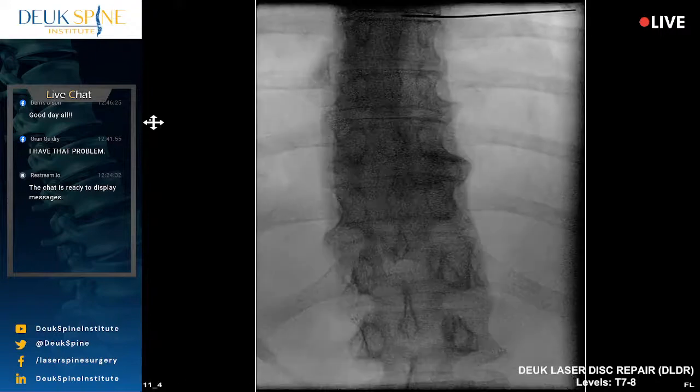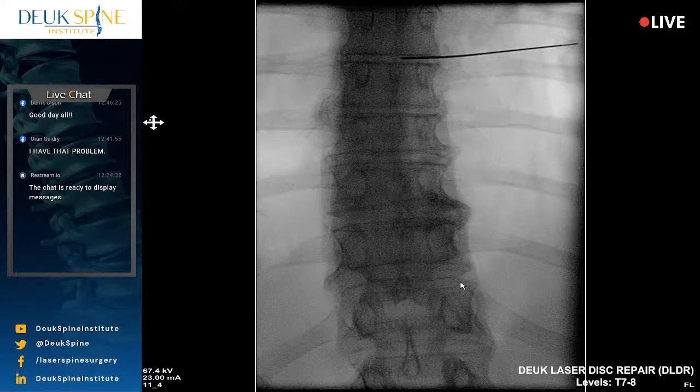Relax. Beautiful. So we're in, and there you see 12, 11, 10, 9, 8, 7. Go up about 2 inches and show them the 12 pedicle we have the arrow on, so you can see. There it is: 12, 11, 10, 9, 8, 7. We are in the 7-8 disc. Very happy? Not yet. All right, you can go back to a lateral view. Are you comfy?